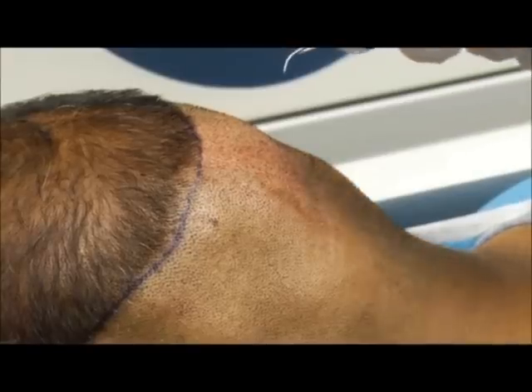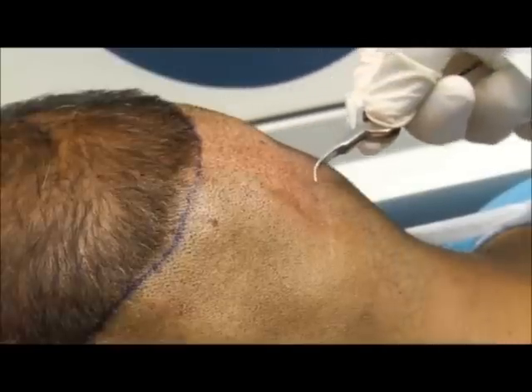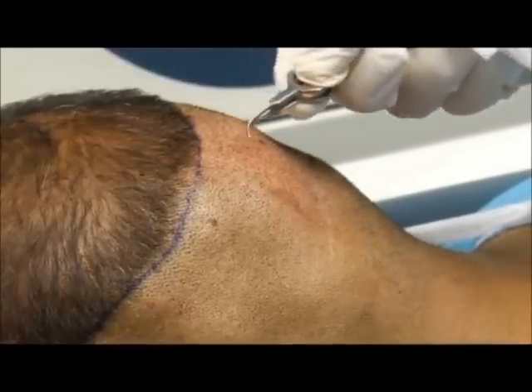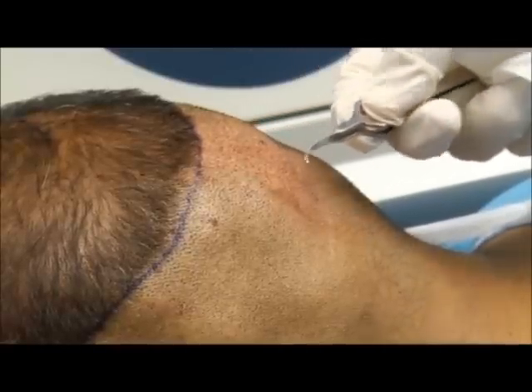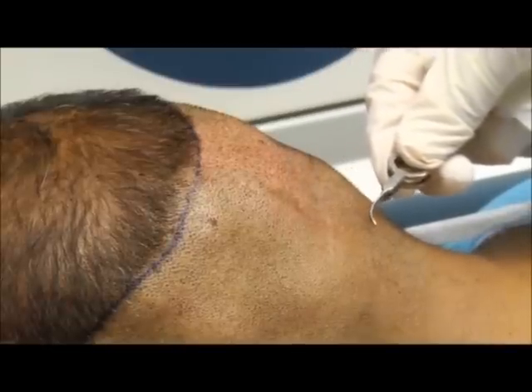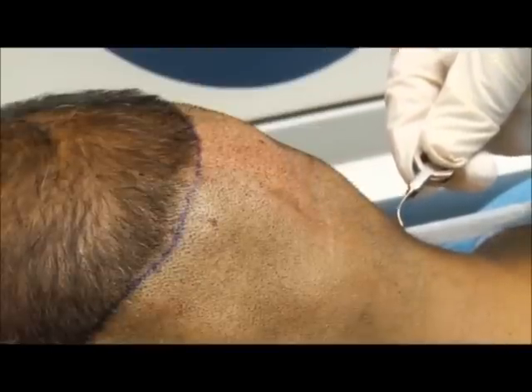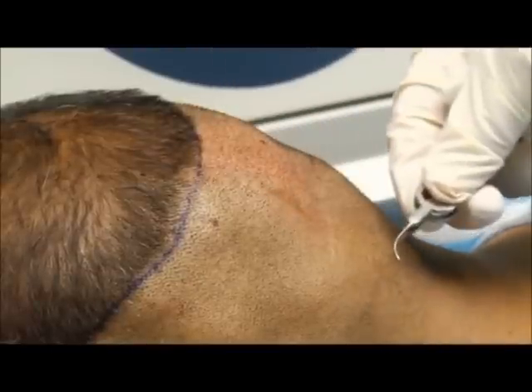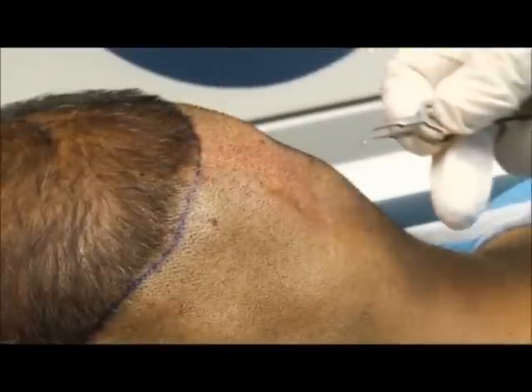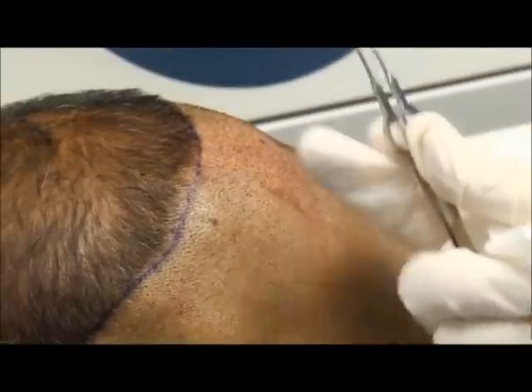We just finished harvesting two grids, and you can see how we've overlapped them so they form one continuous area of harvesting. The third grid will be placed below the first two, and then perhaps a fourth grid before starting a new column. The grids will overlap both vertically and horizontally as we move across the harvest area.